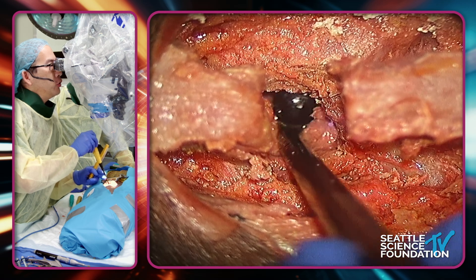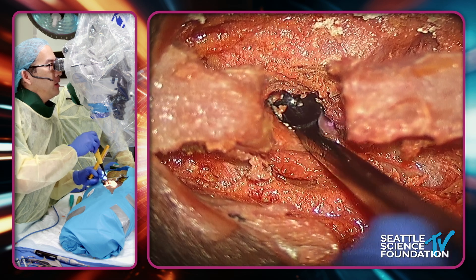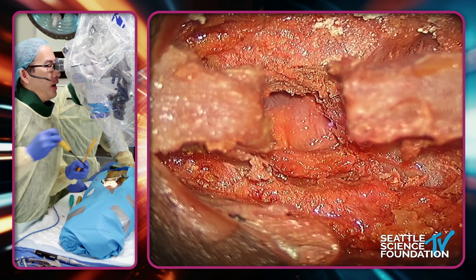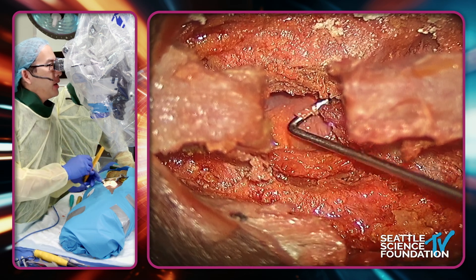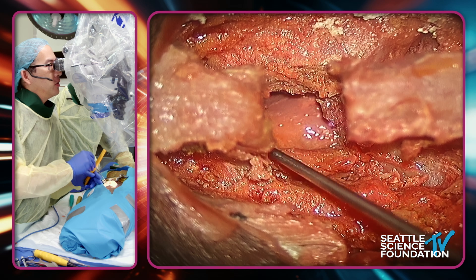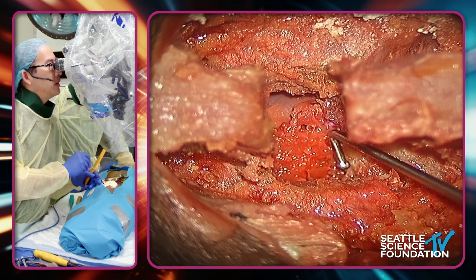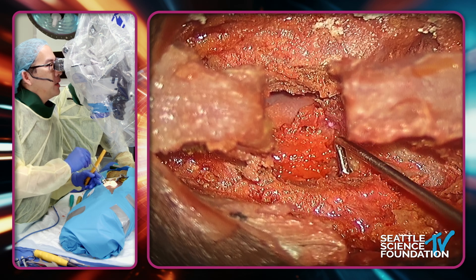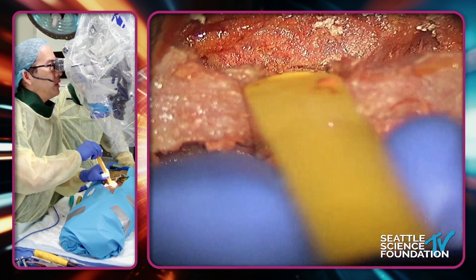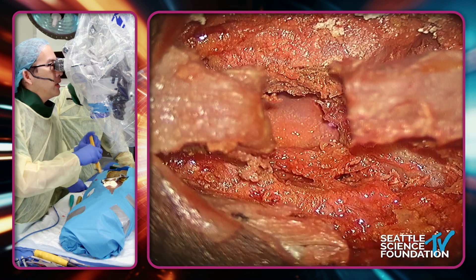Every day I have to do this in the mornings and then talk to the patient in the afternoon. If I don't get this ligament out, I can pretty much expect that they're not going to be happy with me. I always have that voice in the back of my head saying: am I okay if I'm L5 here? Am I okay if I'm L4? You can see clearly this is so nicely decompressed compared to the side that hasn't been decompressed. We've trimmed the landing zone and we're ready to go. Testing this — it looks about the right lift, just about two to three millimeters. It's quite nice.